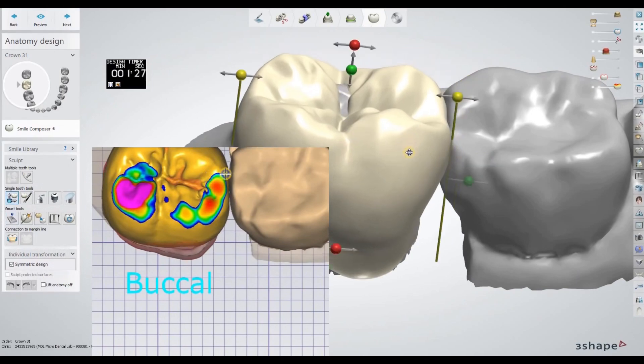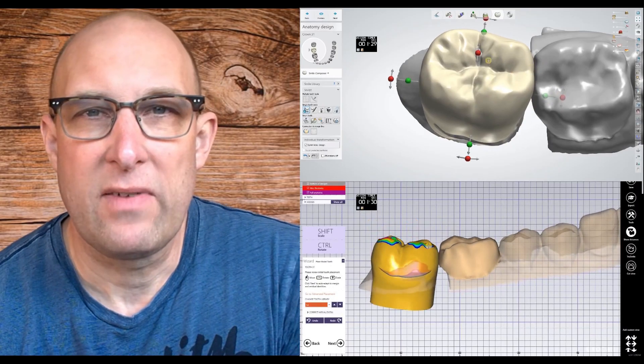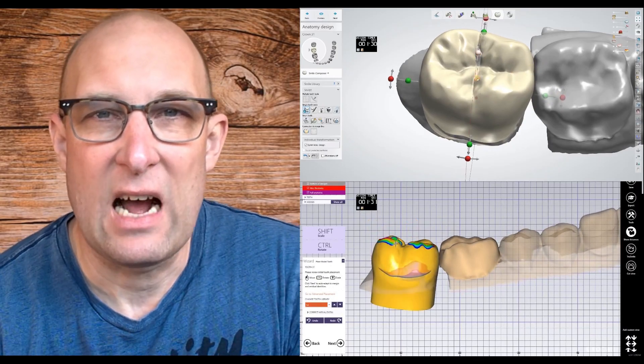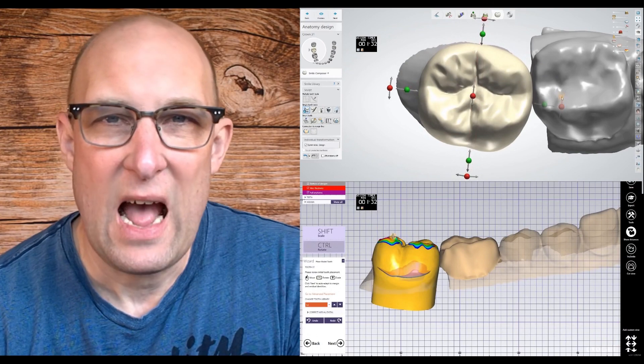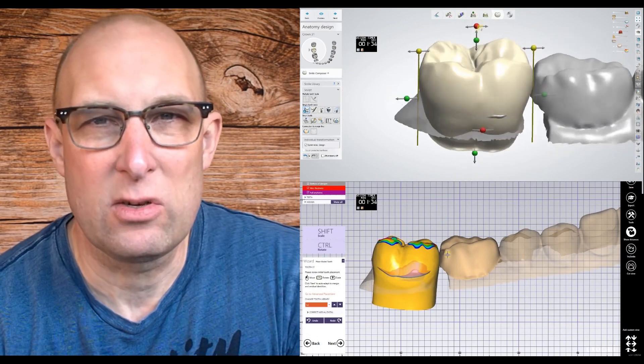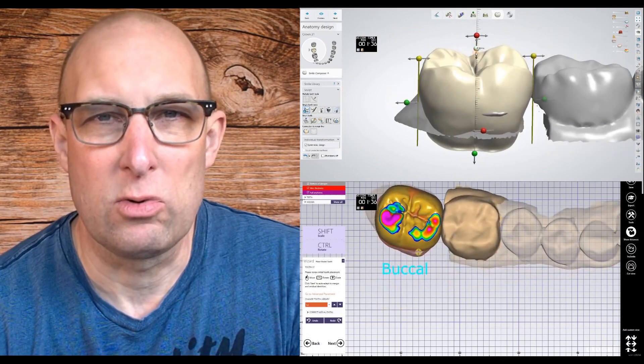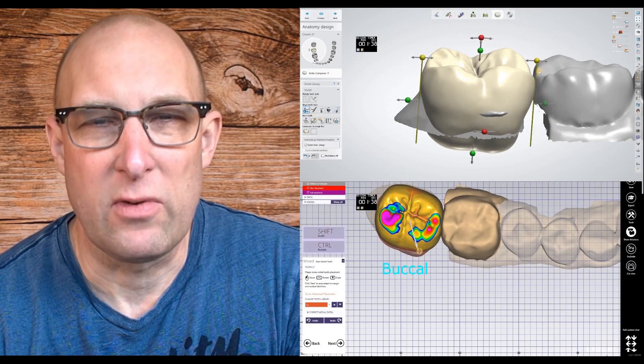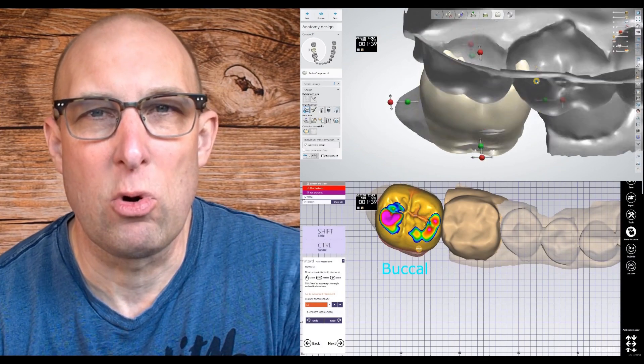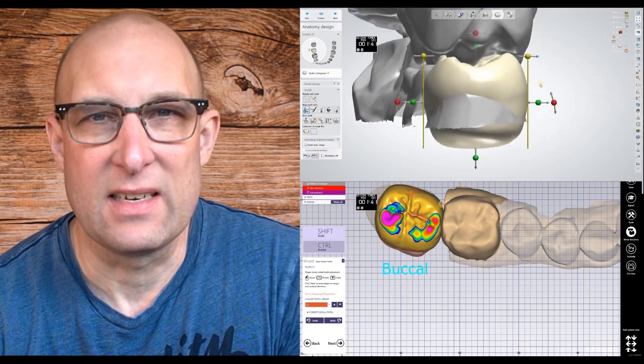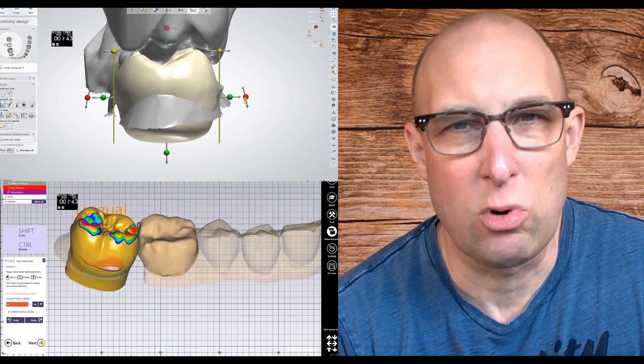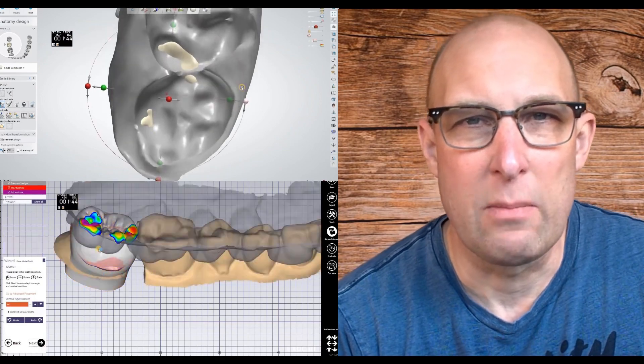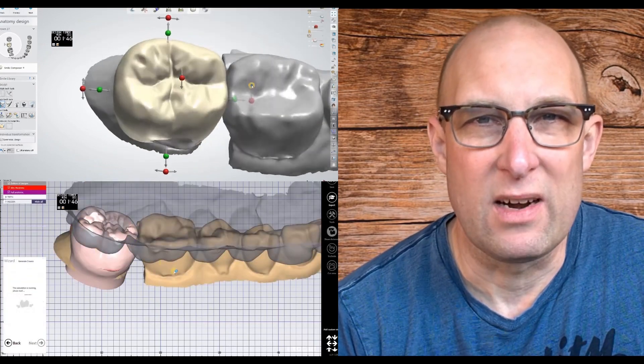In terms of functionality for shaping teeth, I like exocad a little bit better because you have the freedom of controlling the shape of the tools. For example, if you hold the shift key, you can scale it. If you hold shift and control, you can morph it in any way you want.